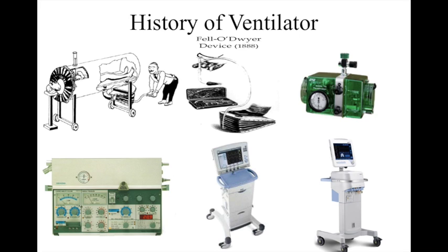Several generations of ICU ventilators have existed, each with features different from the previous generation. All of the advancement in ICU ventilator design over these generations provides the basis for speculation on the future. ICU ventilators of the future will be able to integrate electronically with other bedside technology. They will be able to efficiently ventilate all patients in all settings, invasively and non-invasively.